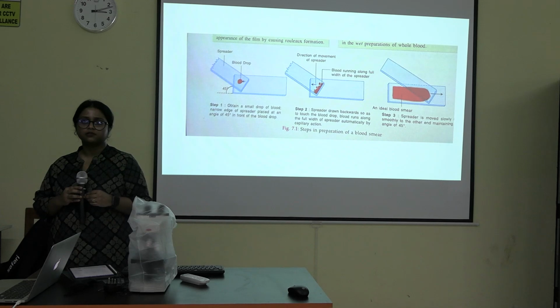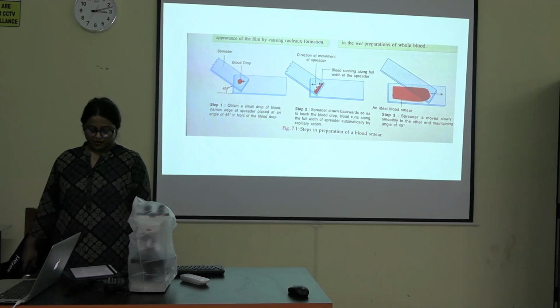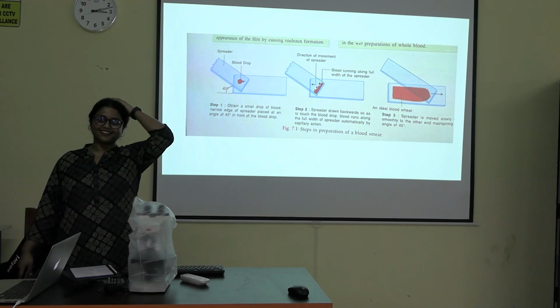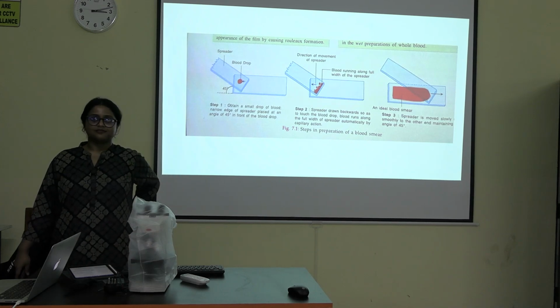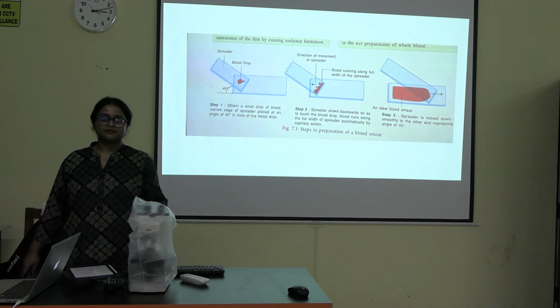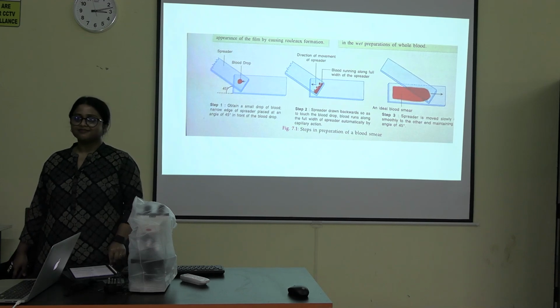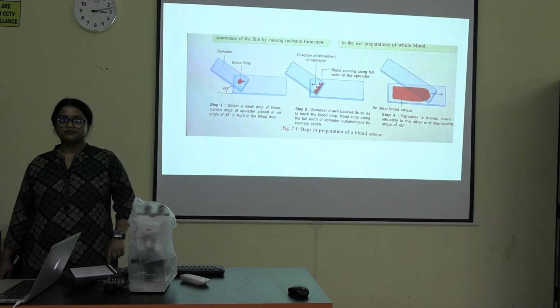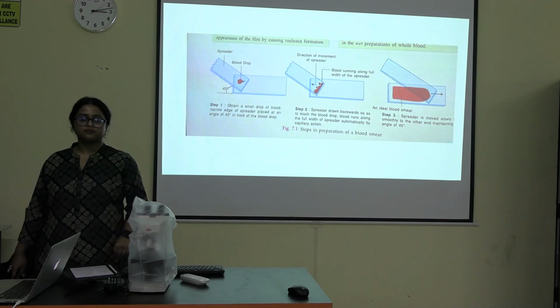I will ask one more question. Lymphocytes. In lymphocytes, what type of granules will you find? You don't know? Okay. Can you tell? Whether these lymphocytes will contain granules or not. There will be granules.